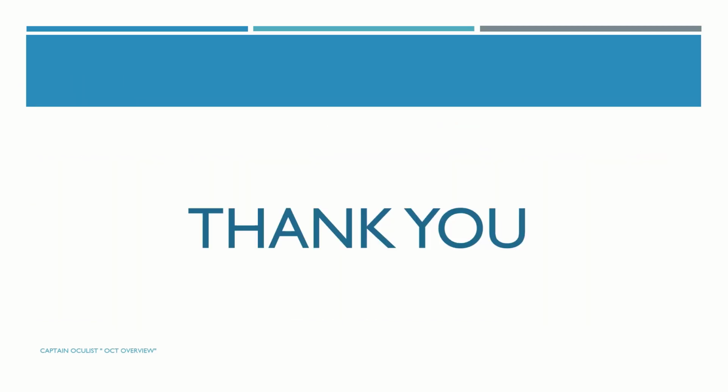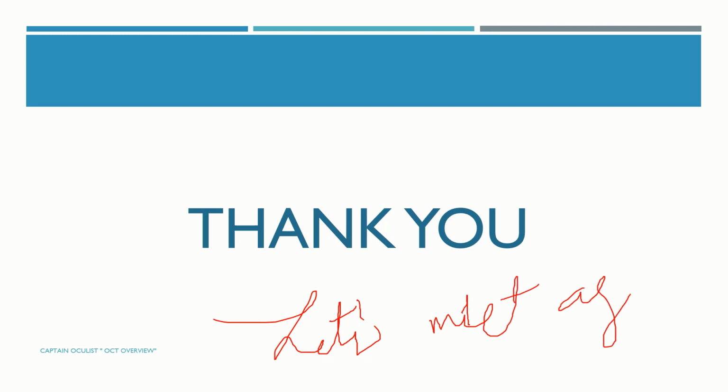That's it for today. I hope you have enjoyed it and learned something different today. I did my best to make it as short and as productive as possible. I will make some more videos about this, like how to do fundus photographs and how to do anterior segment. I have made a very quick and easy guide for students. Anyone can learn OCT by watching these slides. Alright.